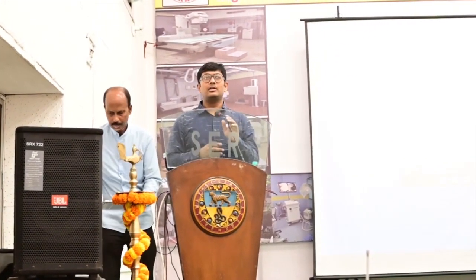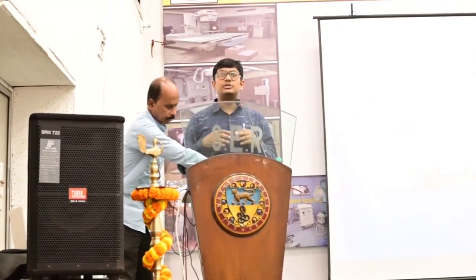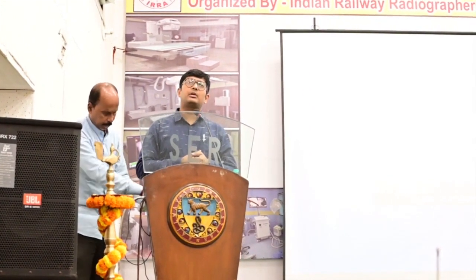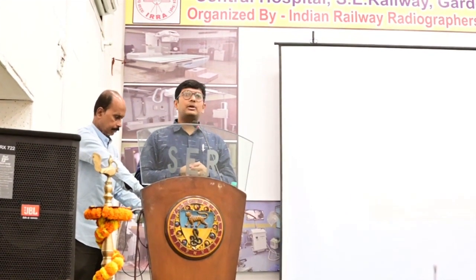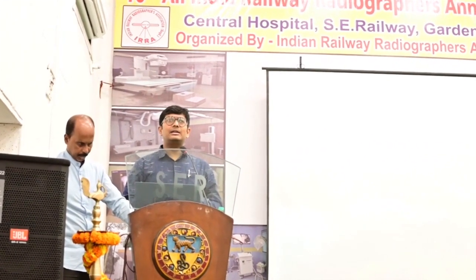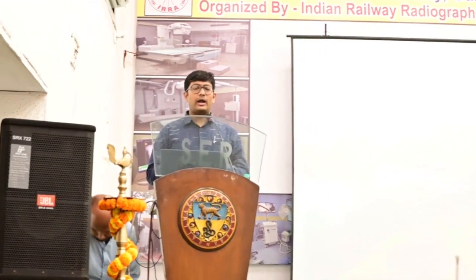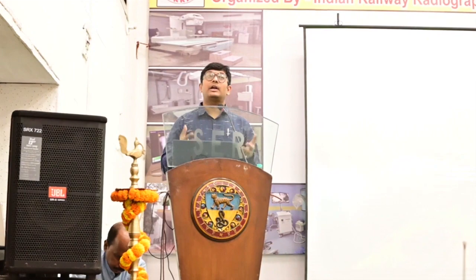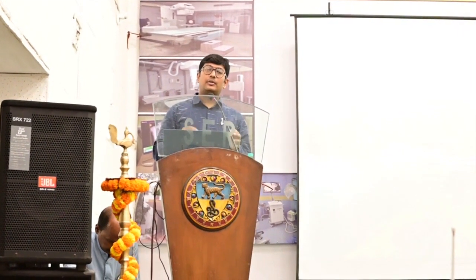And how do you identify that? There are 3 or 4 ways to identify. If you ask me as a radiologist what is the best technique to identify, a very easy tool is CT perfusion in anterior circulation. In posterior circulation, CT perfusion may or may not help. Number 2, if CT perfusion is not available in a setup, like in the majority of the setups where I perform, you can get a DWI-FLAIR mismatch, which means you still have a lot of penumbra. But actually, it is not always true. Why? A FLAIR loss only tells you that the time window is more than 4.5 hours. It doesn't guarantee you that opening the vessel or revascularizing it won't save the tissue. So it doesn't guarantee you.